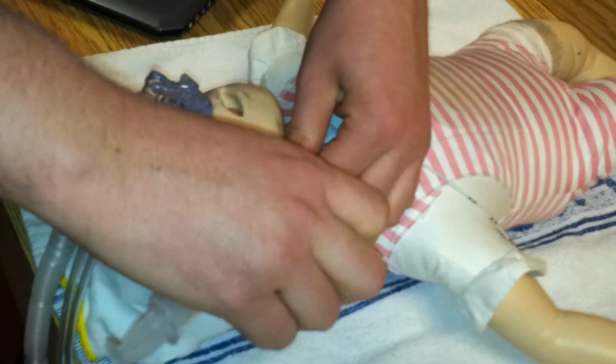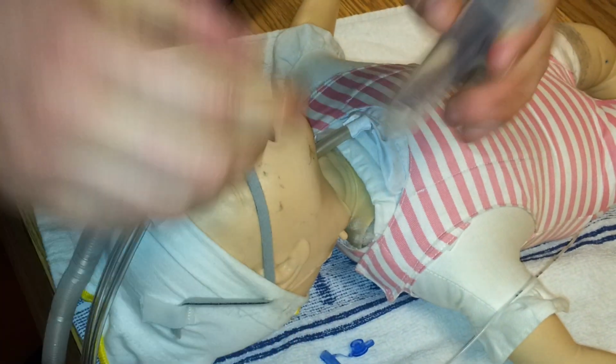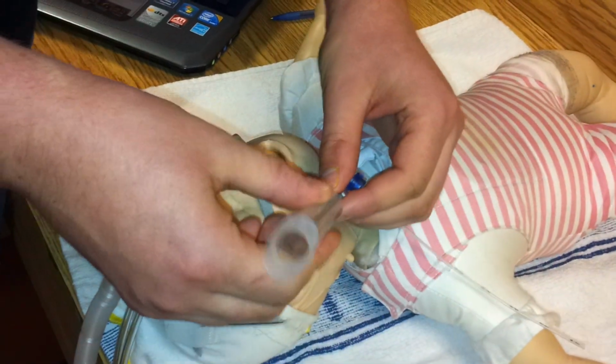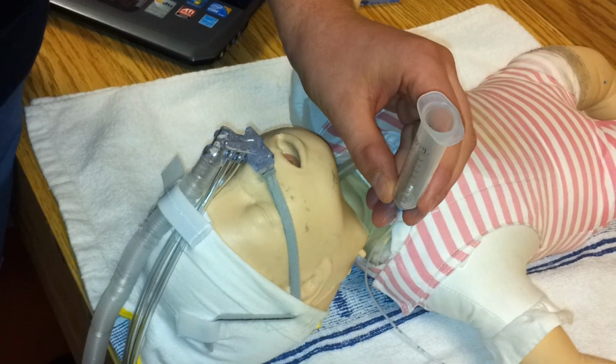Disconnect the syringe. You're going to take the back part off. Some people put a little cotton ball in there. And you're going to reconnect it. And basically just have it open to atmosphere to vent any gas that gets pushed into the stomach.